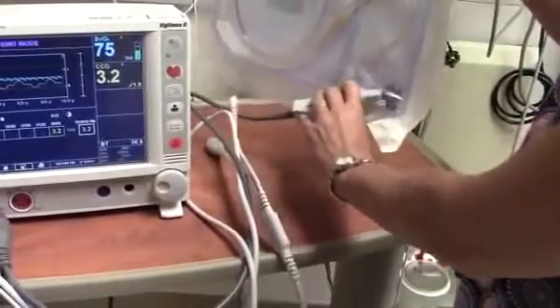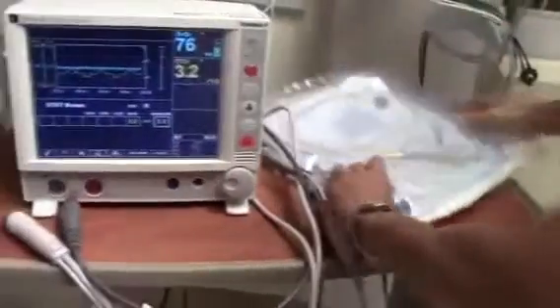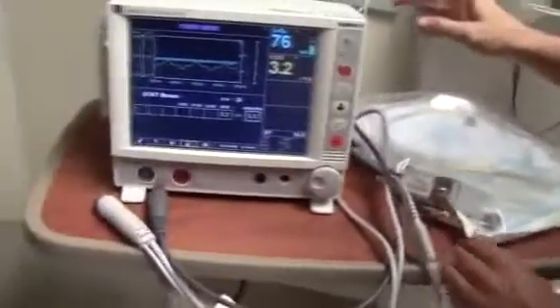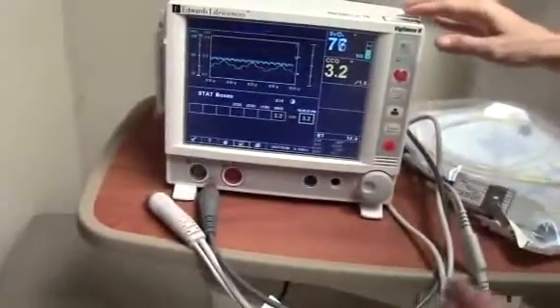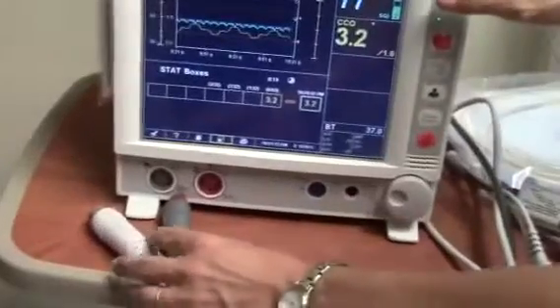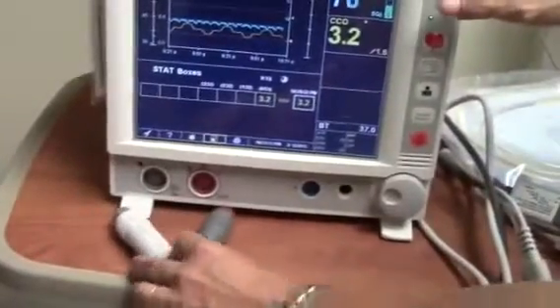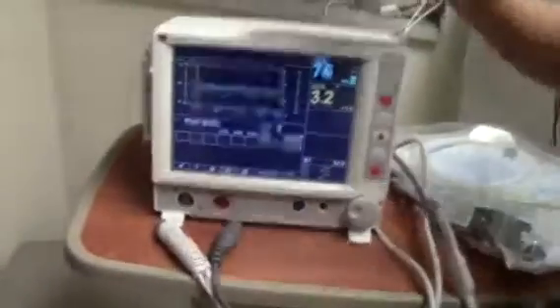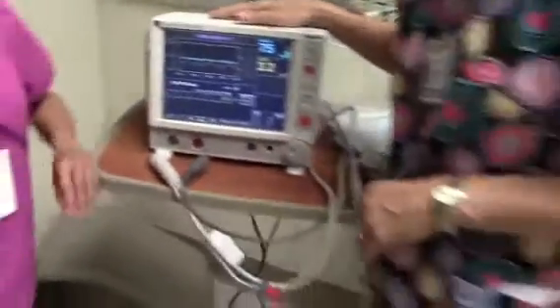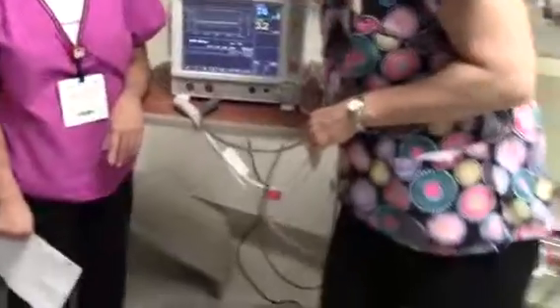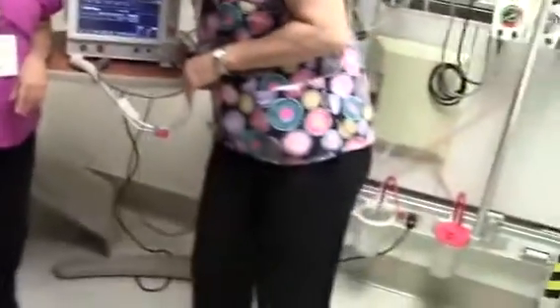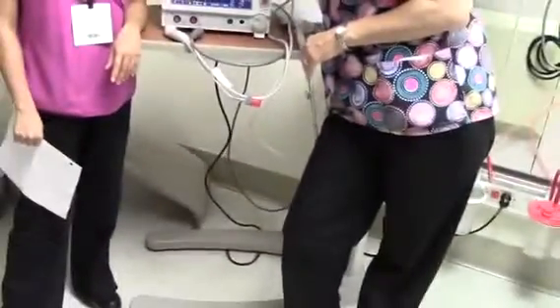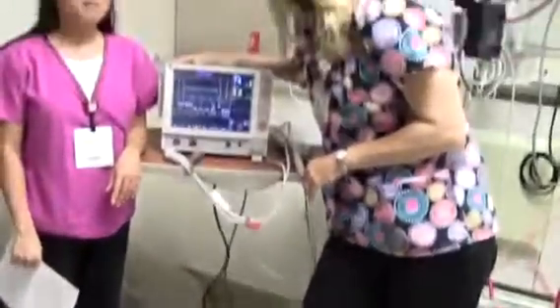When the patient returns to the room, repeat recall OM data. Thank you. We hope this has been helpful.